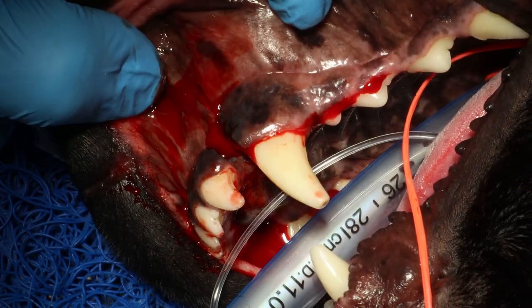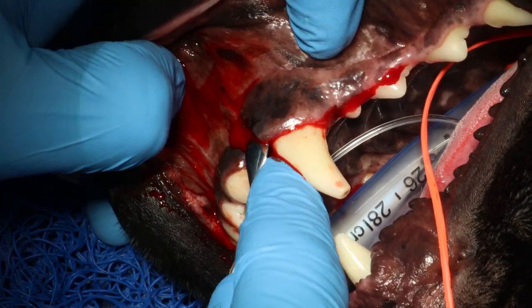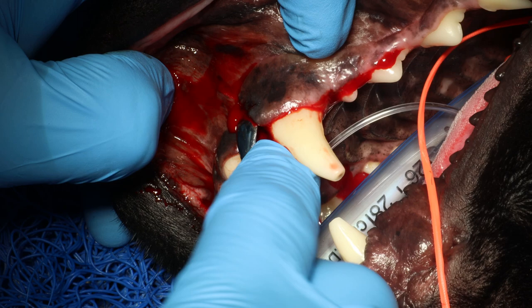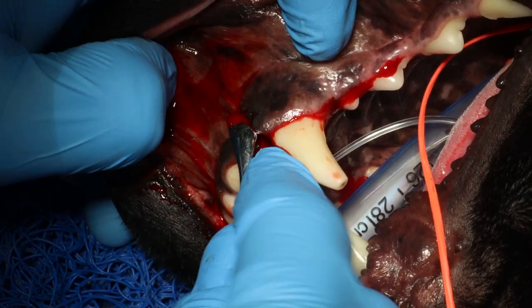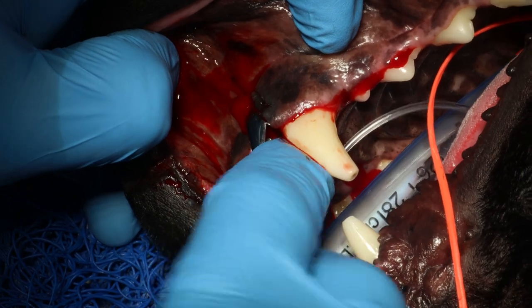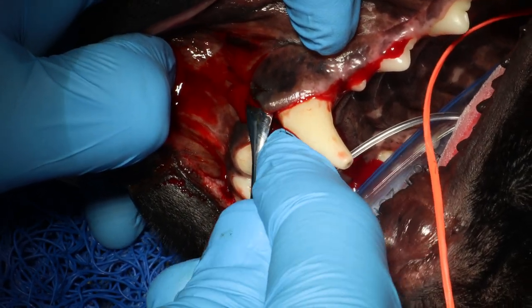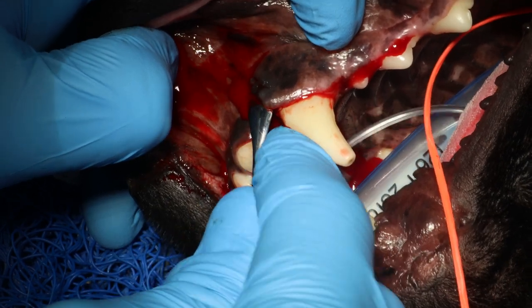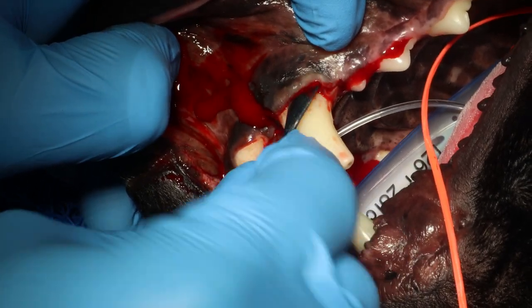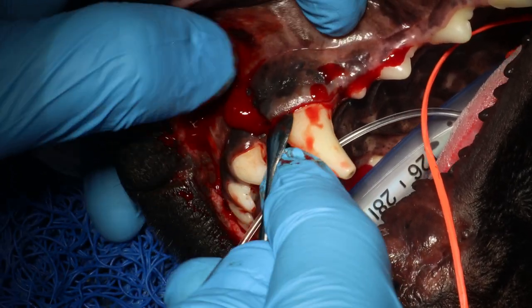When you have to release the gingiva off of the tooth, I always start at the corner and I twist. This mesial part here is the most tricky. You want nice sharp periosteal elevators and you want to do a twisting motion — keep very firm pressure against the tooth or against the bone and do a twisting motion while you push: twist and push.